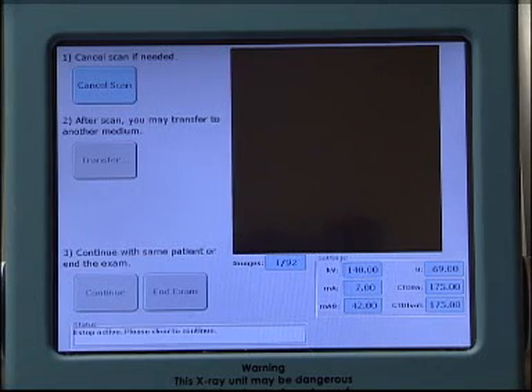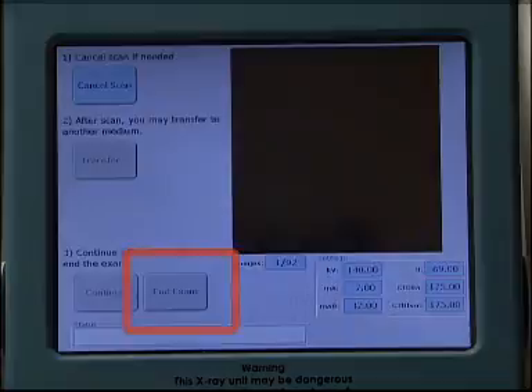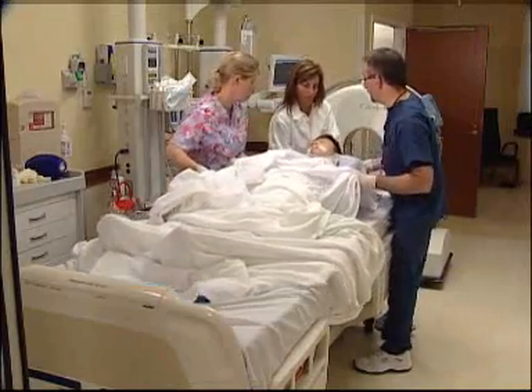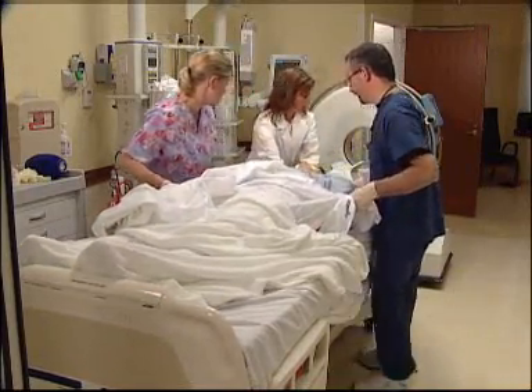Proceed to the patient's bedside. Choose End Exam on the LCD screen. Completion of the scan. With the assistance of the nurse, slide the patient off the scan board onto the bed. Remove the head strap from the patient.